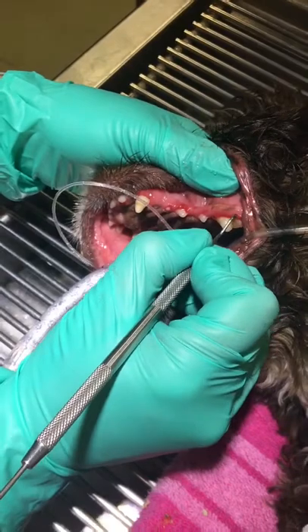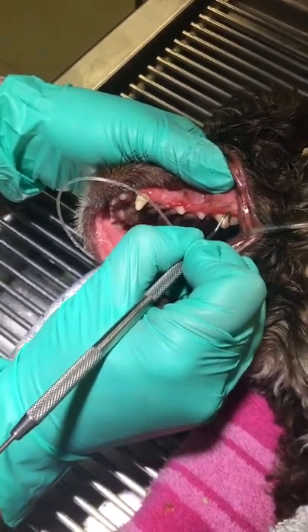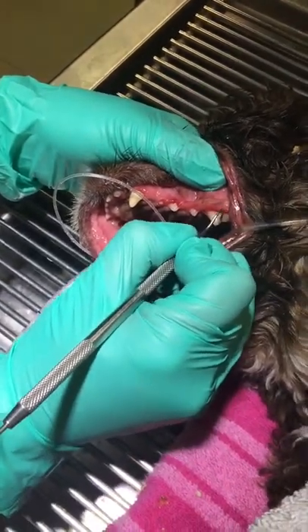For places hard to reach with your ultrasonic scaler, you can use the hand scaler to remove plaque and tartar.